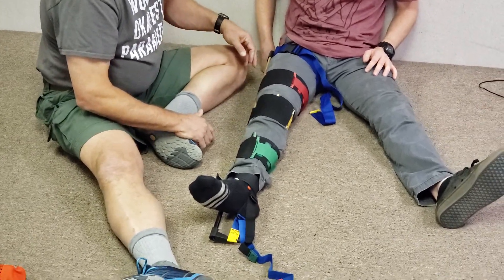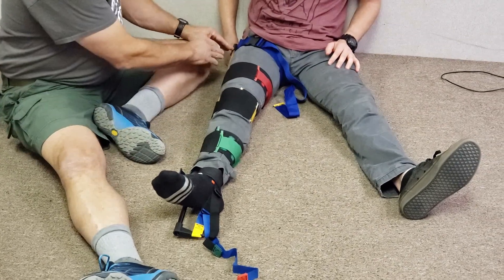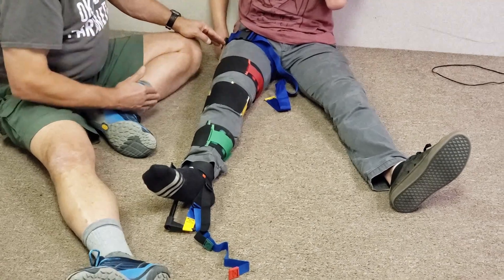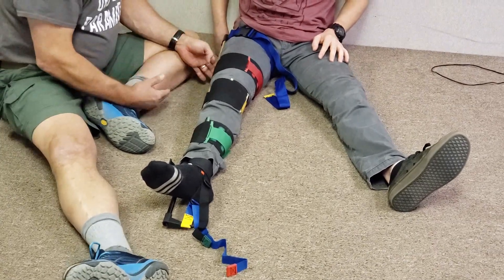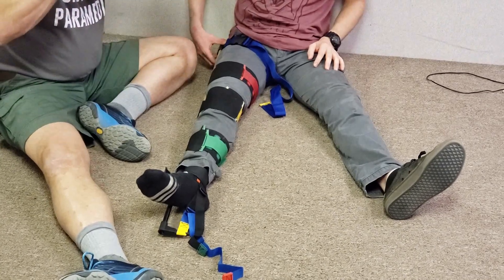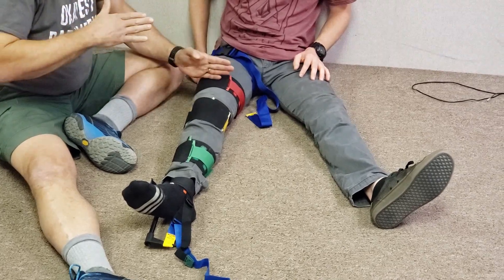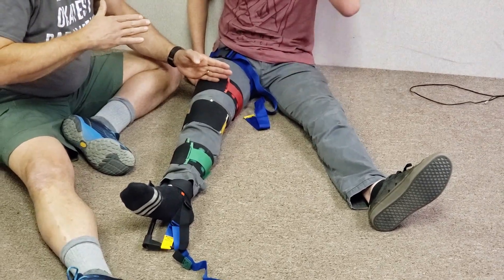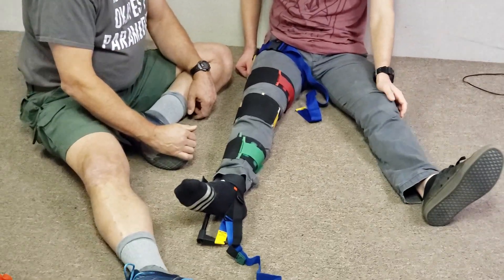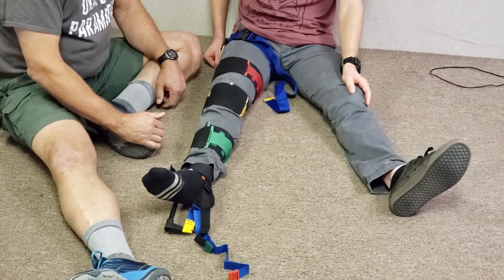When you first applied traction you probably needed more traction strength because the muscles were in spasm, but over time the muscles start to relax. Once the patient is loaded, ask again whether the leg is feeling better, worse, or the same. If the patient says the leg is starting to ache more, carefully back off on the traction and ask the patient to tell you when it gets better again.